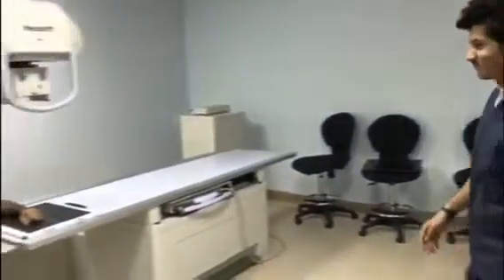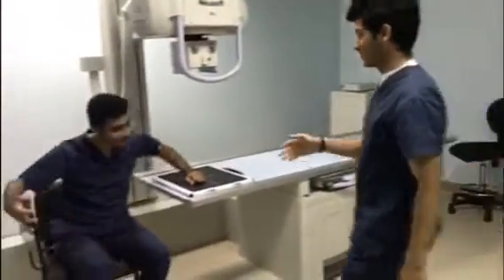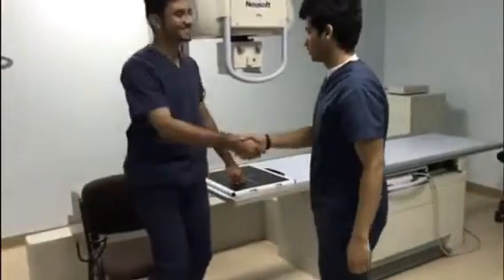At the end of the procedure, the specialist takes the patient out of the room.